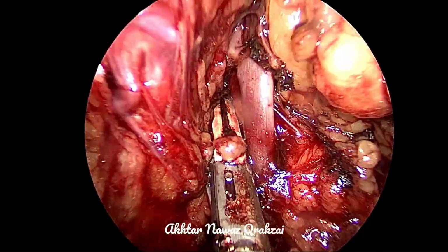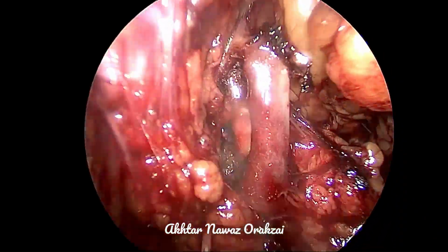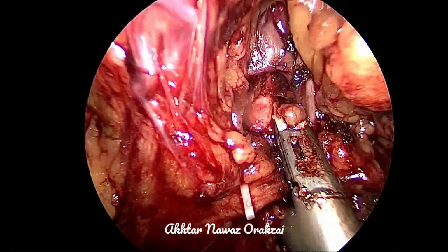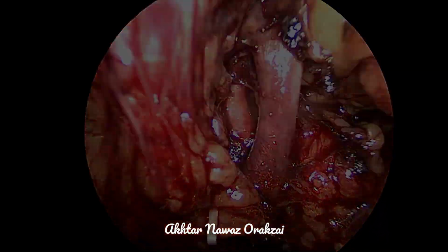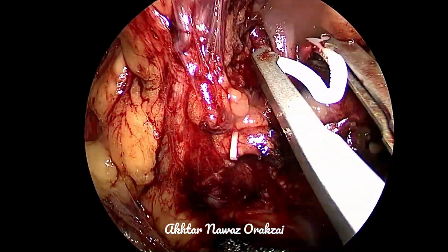rest of the pedicle. So we found a pulsation here. Is a big artery just posterior to it. However, as we have seen two veins here, I'm expecting another artery as well.